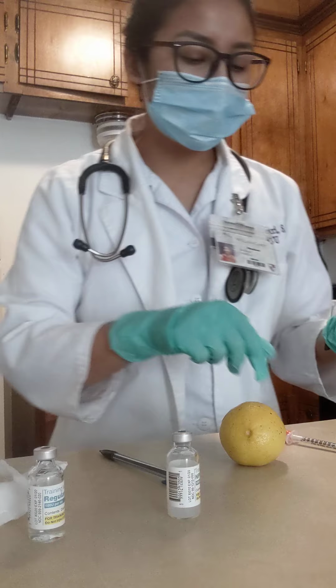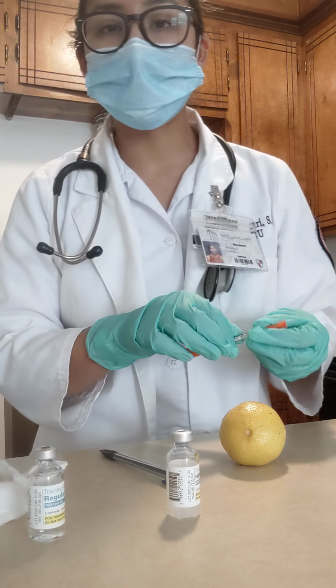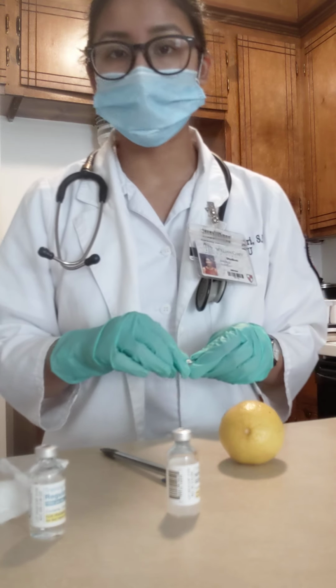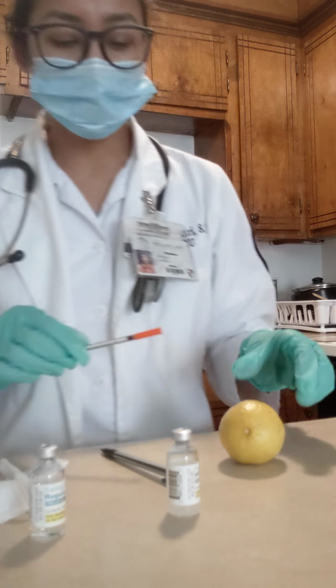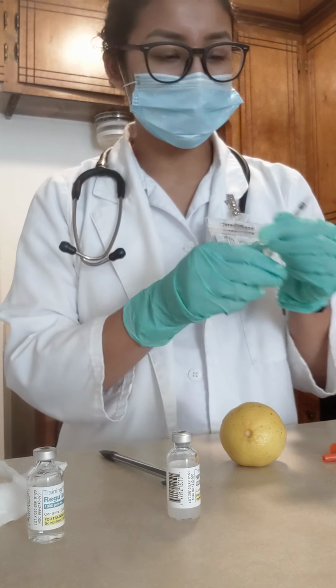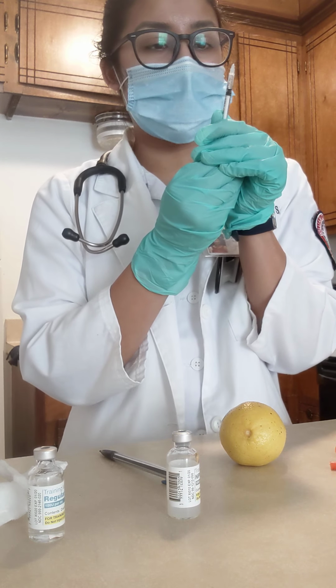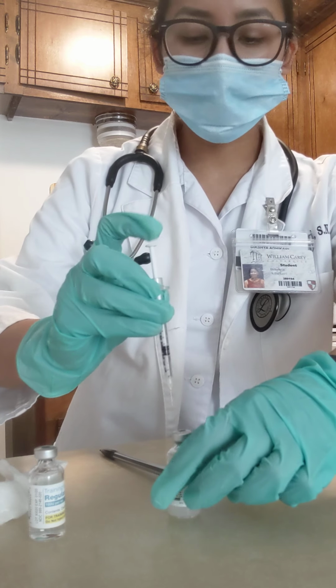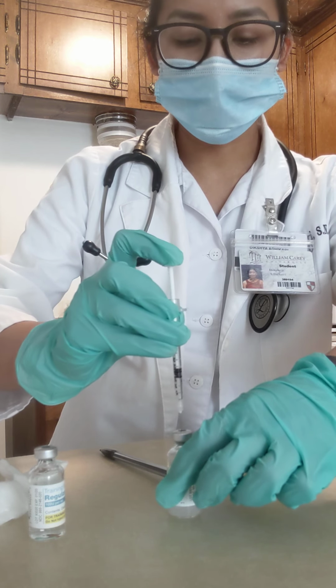Now since the NPH insulin is 16 units and the regular is 6 units, the total insulin that I'm going to give today is 22. I'll aspirate 16 units of air in this syringe, and I'll inject that into the NPH insulin vial without touching the top of the solution.